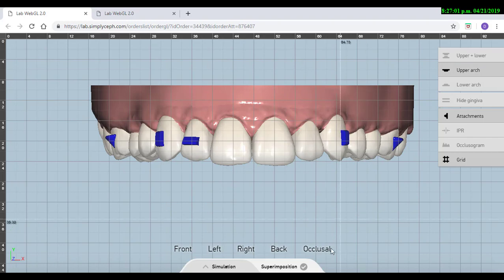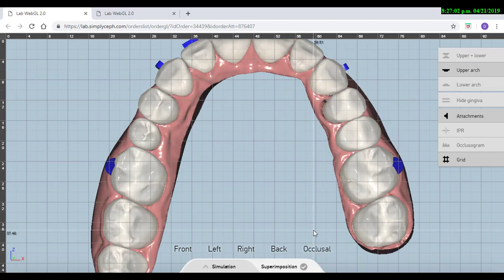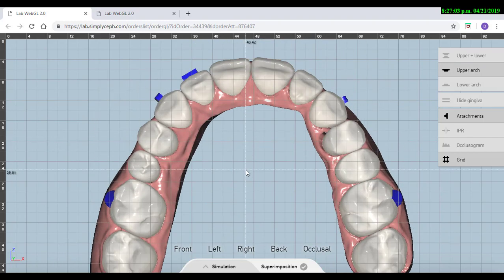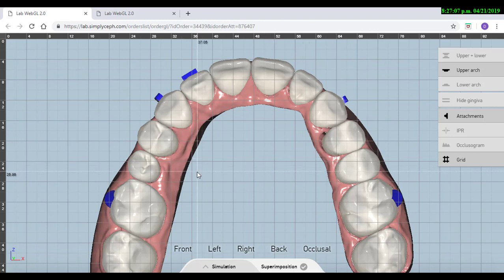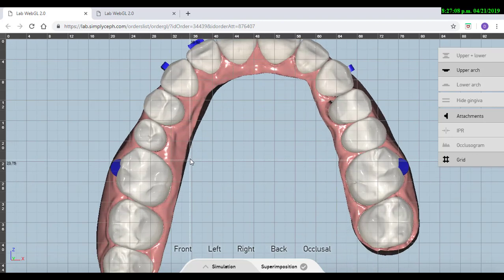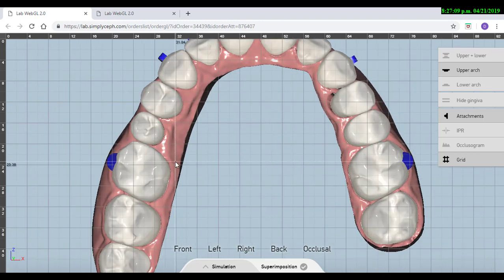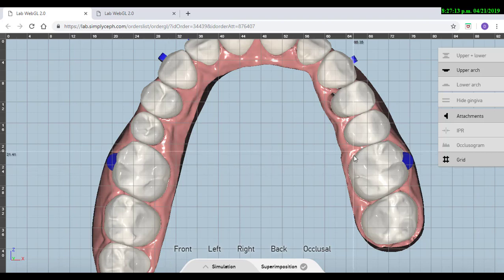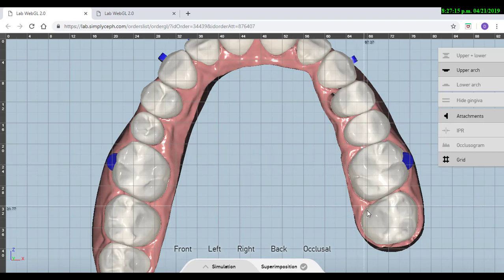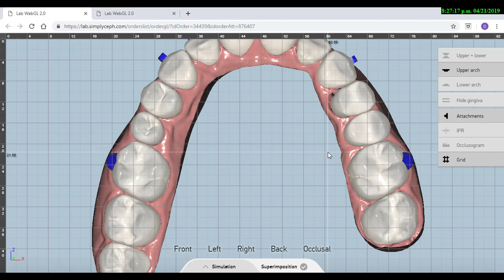Then I want to check the arch shape. Normally we want an ovoid arch shape, and also as a rule, normally the distance between upper first molar to upper first molar from lingual surface will be around 35 to 39 millimeters, so that is also something that I can check in here.